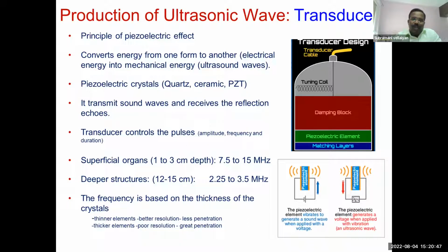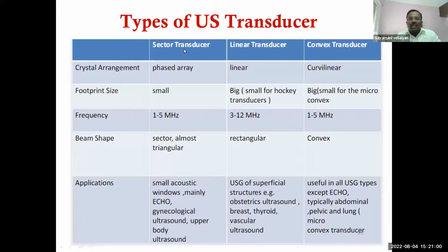So the thinner the element, the better the resolution. That means lesser penetration or propagation. The thicker the element, the poorer the resolution, and greater the penetration or propagation. So this is the basics about the transducer.